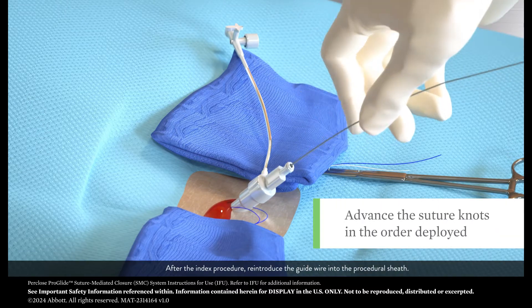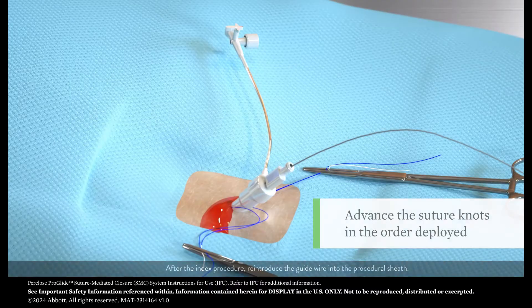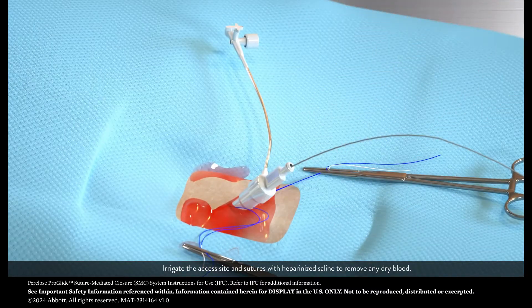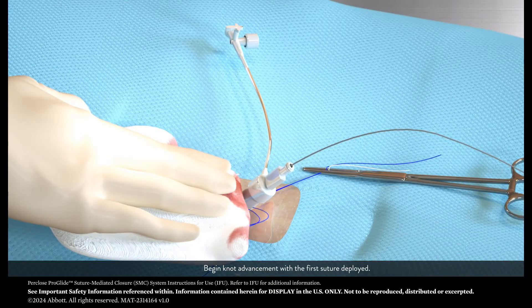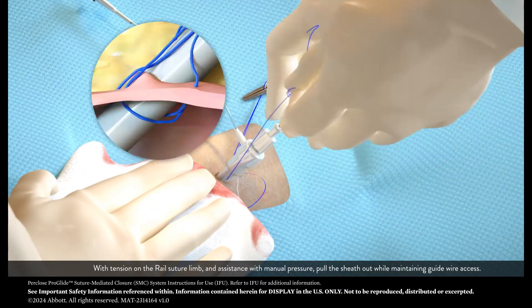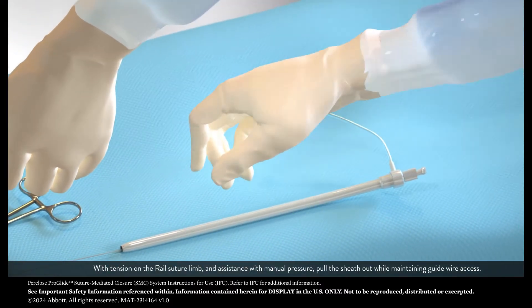After the index procedure, reintroduce the guide wire into the procedural sheath. Irrigate the access site and sutures with heparinized saline to remove any dry blood. Begin knot advancement with the first suture deployed. With tension on the rail suture limb and assistance with manual pressure, pull the sheath out while maintaining guide wire access.